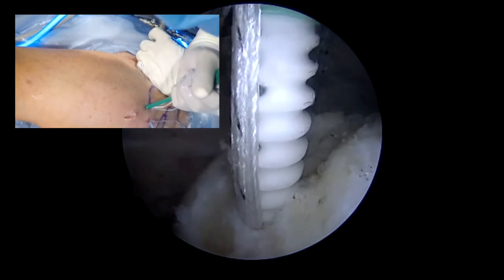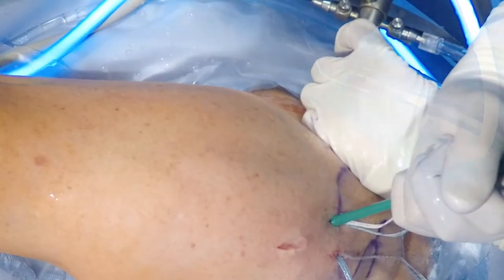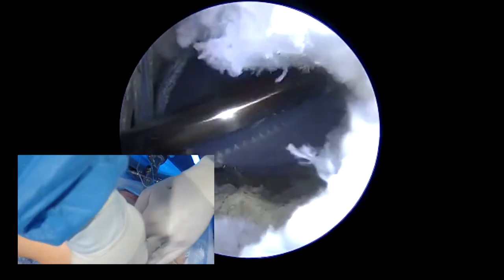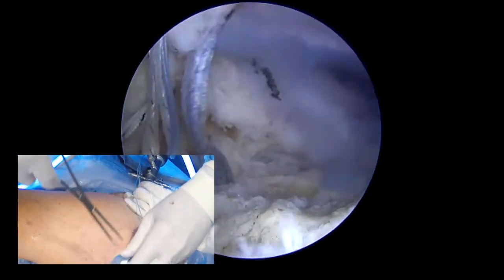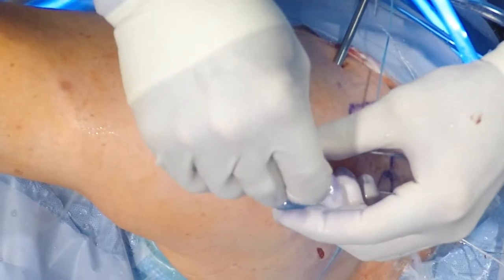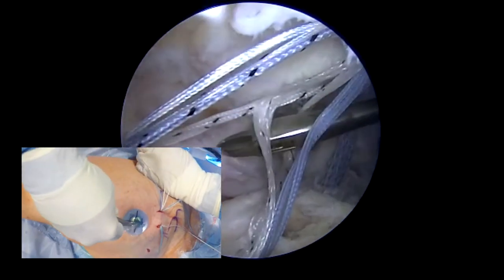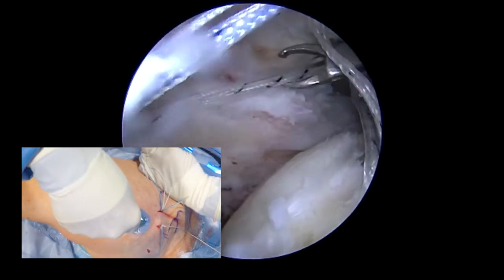Once we screw those anchors in, we'll have to deliver the sutures externally. At this point, we add the special lateral rubber cannula, which we'll be using throughout the procedure. In order to assist with suture management, we use this inserter that essentially separates the region into four quadrants, so that we ensure that the posterior sutures go in that direction. We're now retrieving the shuttling stitch from the knotless corkscrew anchor that's in the superior glenoid.